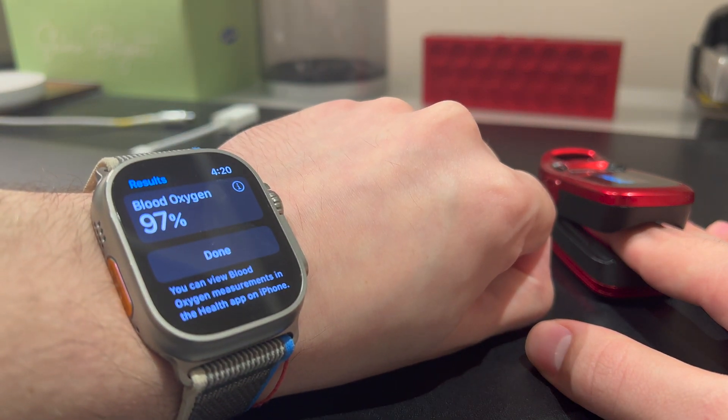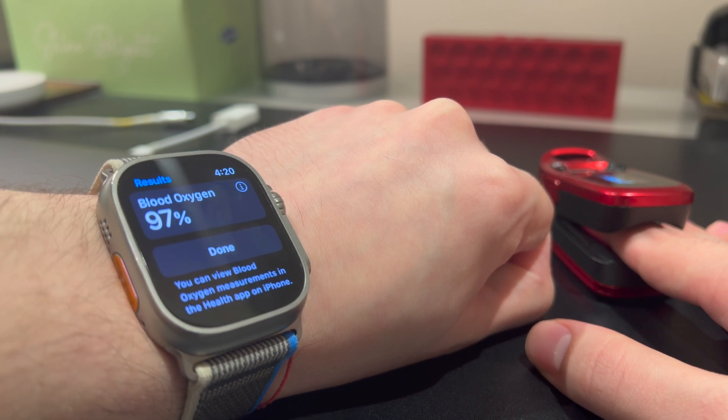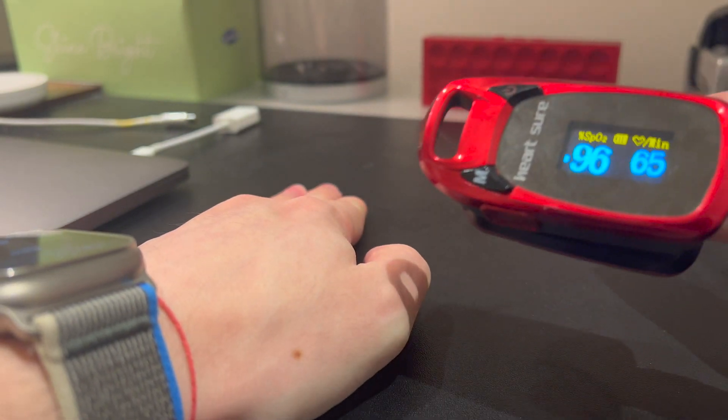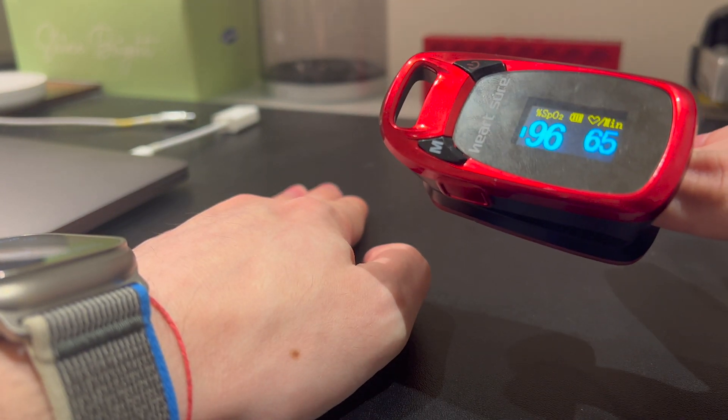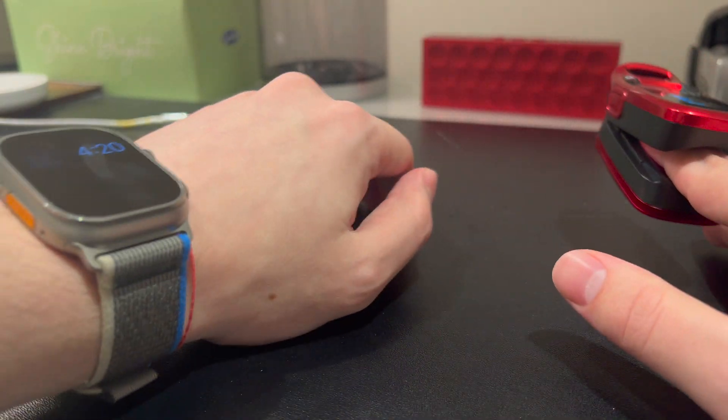As you can see here, it's showing 97%. I had to do a little cut just because I had to readjust the sizing of the blood oxygen monitor, but as you can see here as well, what was just saying 97% there, now it's 96% — but fairly accurate. Let's do another one just to test.